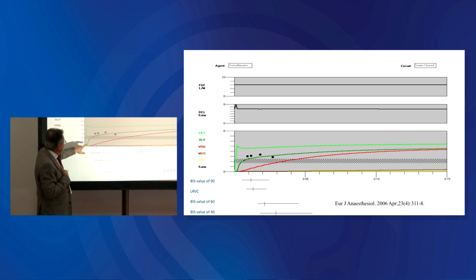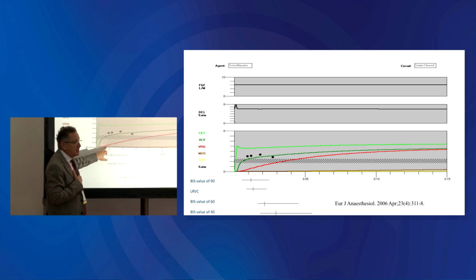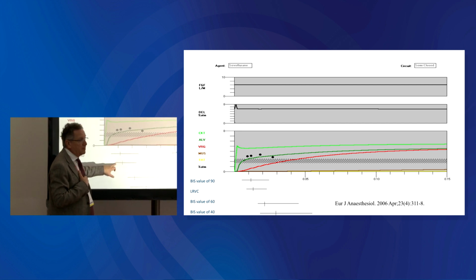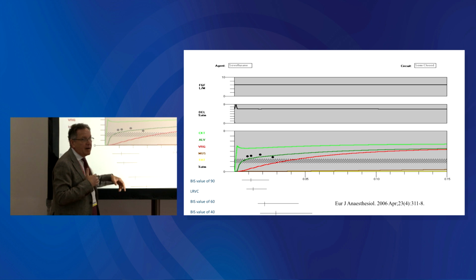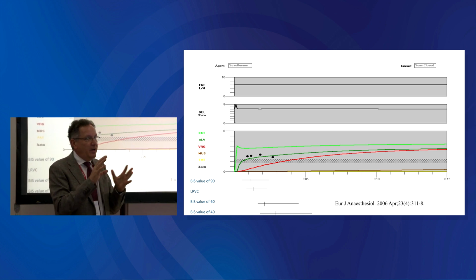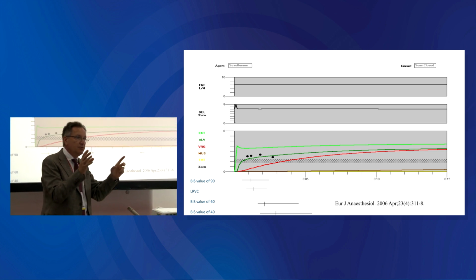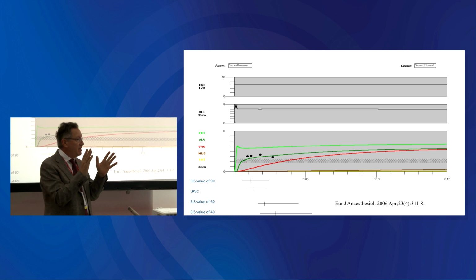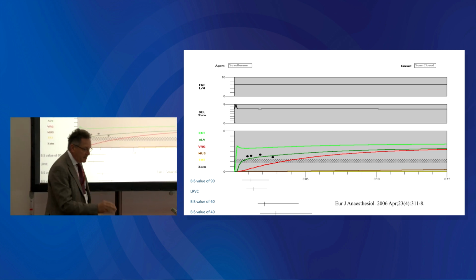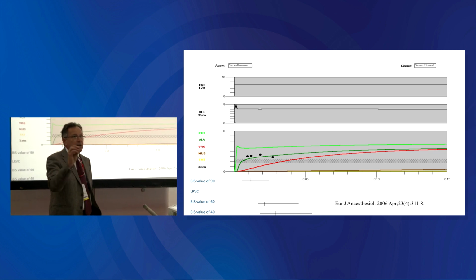And look at this patient. If you look here, loss of response to verbal command, look at the predicted concentration of sevoflurane for that patient who lost it at a very, very low level. So my analysis of the literature is that the way you look at interpatient variability gives you either what Professor Sessler told you, not much of an interpatient variability, or this kind of difference. So the bottom line is that interpatient variability is very large, both for hypnotics and for the opioids.